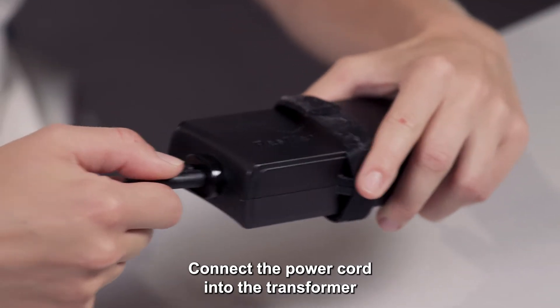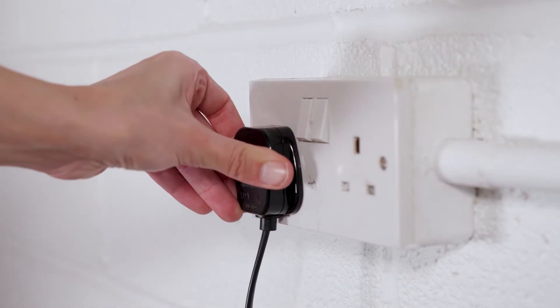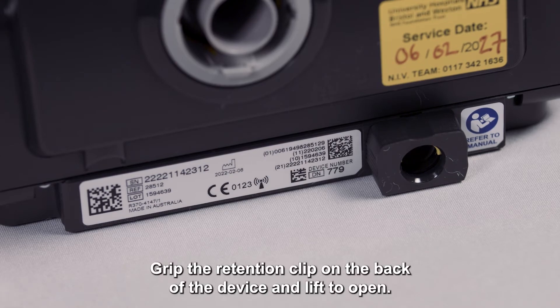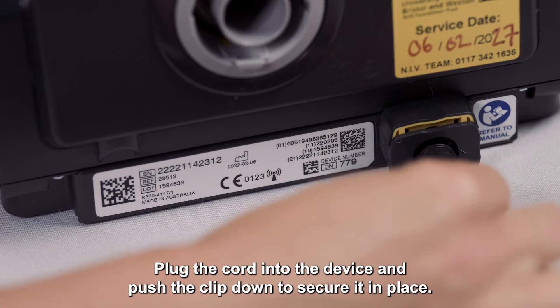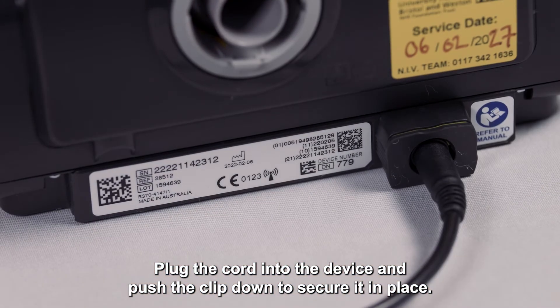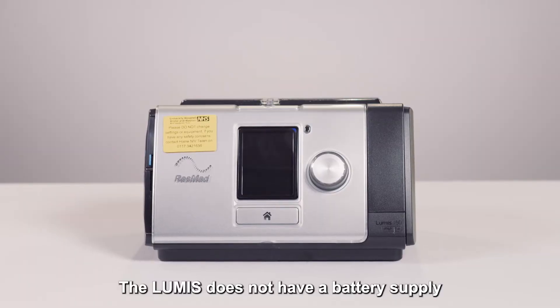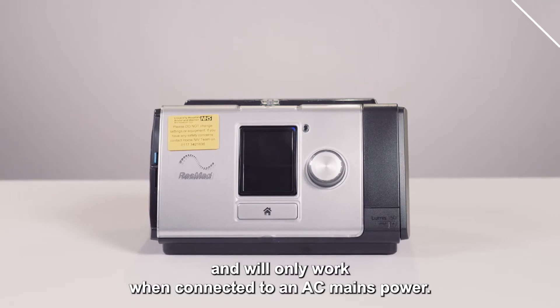Connect the power cord into the transformer and into an electrical power outlet. Grip the retention clip on the back of the device and lift to open. Plug the cord into the device and push the clip down to secure it in place. The Lumis does not have a battery supply and will only work when connected to AC mains power.